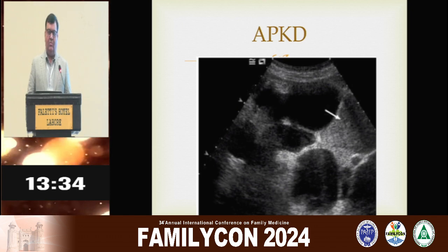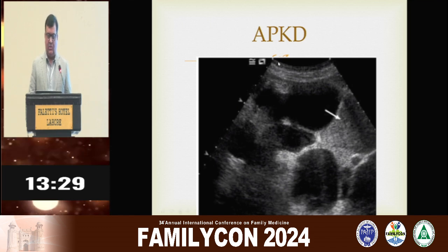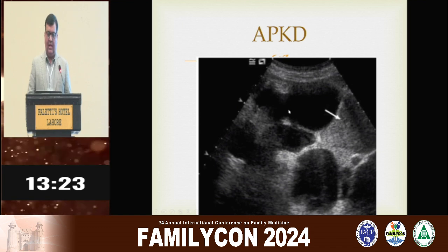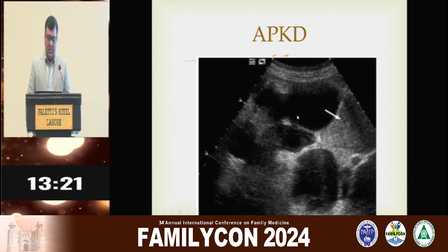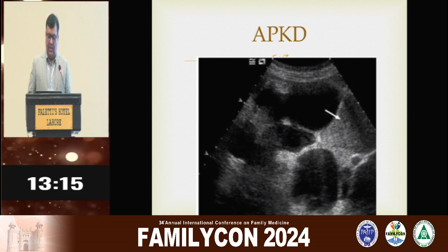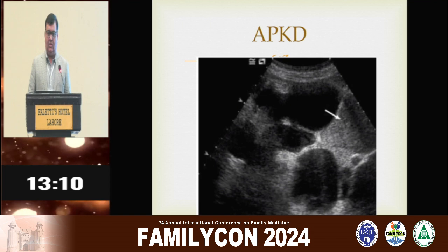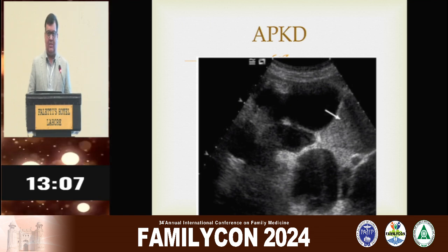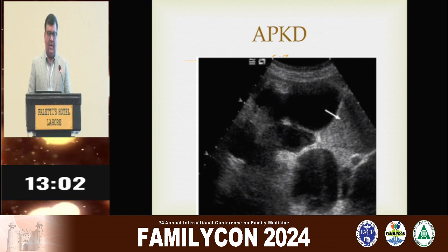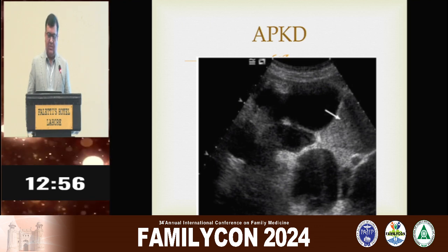Then cysts, which you normally see in patients. Cysts are hypoechoic, anechoic things and show posterior acoustic enhancement. This is how we label a cyst as a simple cyst. The cyst can also be complex. We have the Bosniak classification, which is a CT classification. I will not go into the details. Please do mention any septation, any nodularity, any soft tissue component, because the presence of such things is suspicious for malignancy. And we can do CT in that case to confirm the presence or absence of malignancy.